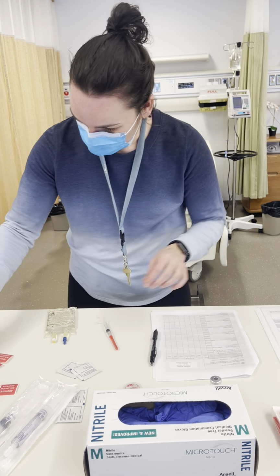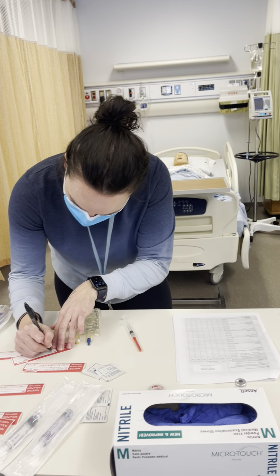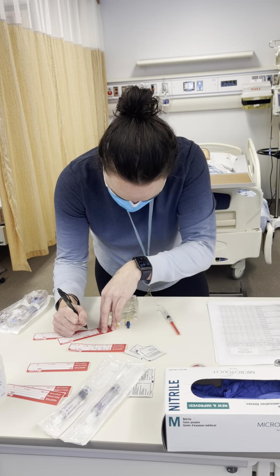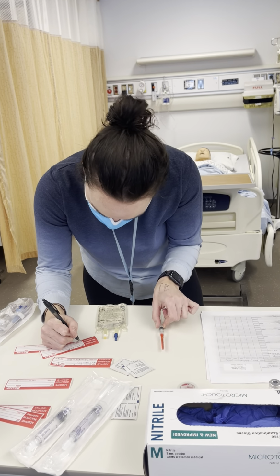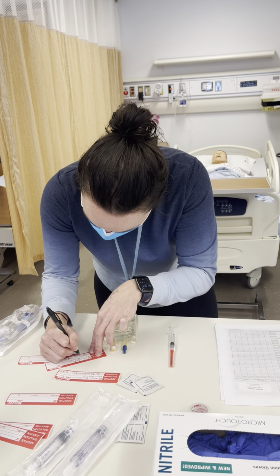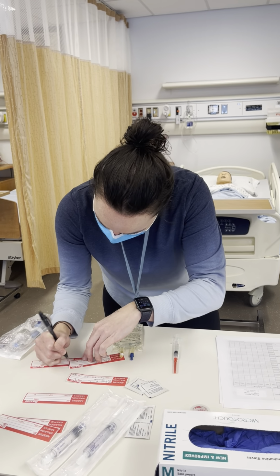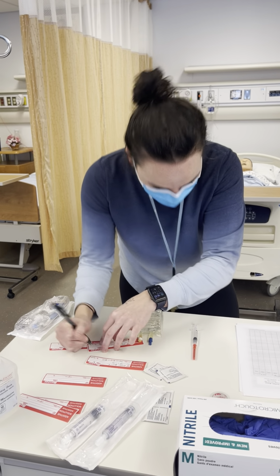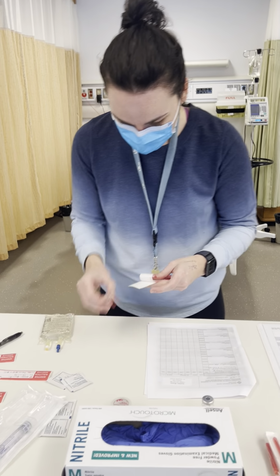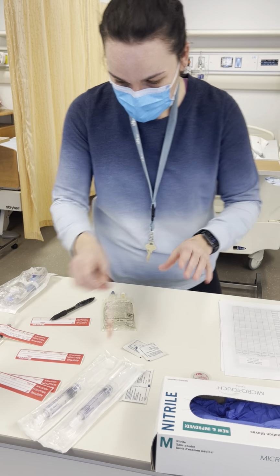And then we're going to label our insulin here. So insulin Humulin R. And we've got our date. We've got our amount too. We've got 1 milliliter, which equals 100 units. We've got the date of March 28th, time 1830, and initial, and we'll put our room number. So we'll label our one. While we're here, we can do our label for our bag too, and our line.